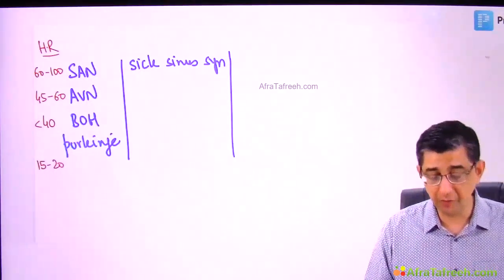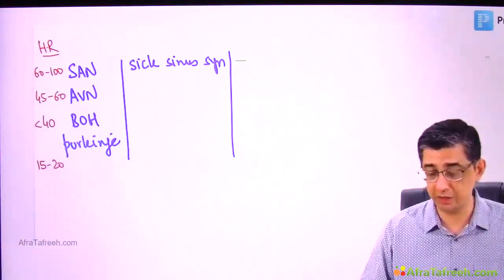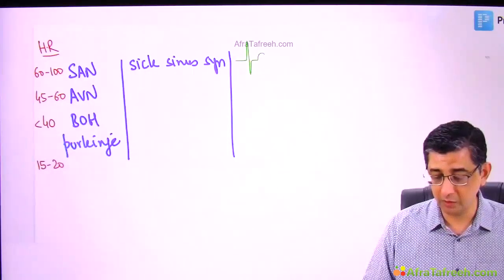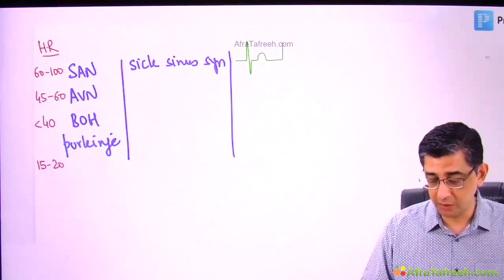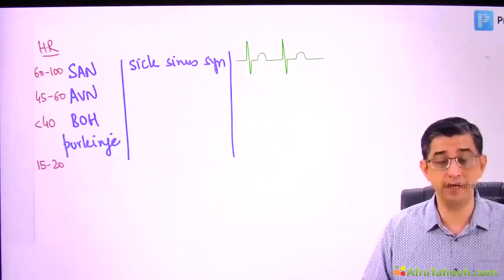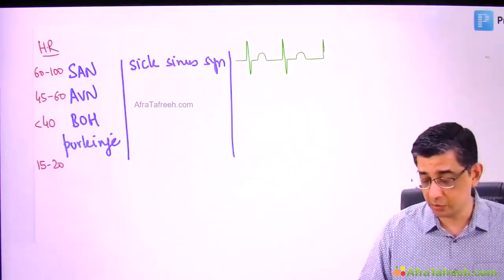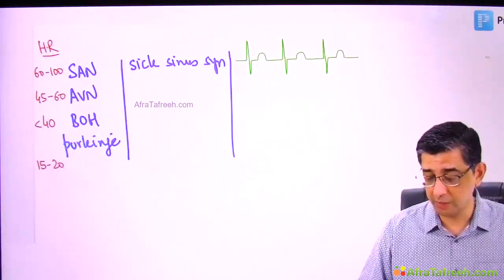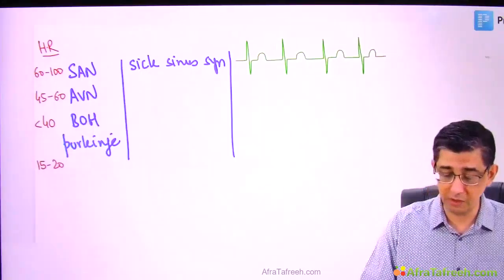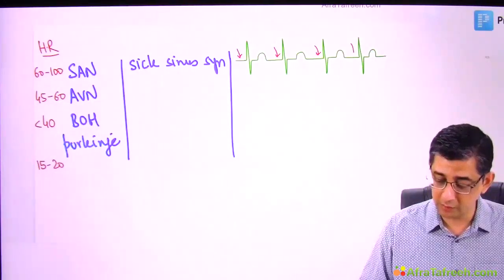Now, in a person who's suffering from sick sinus syndrome, the ECG will evolve like this. There will be no P waves because the SA node is not functioning at the moment. So you will be getting a QRS complex that might be normal, slightly delayed or broad. Then there would be a T wave. I am describing an ECG in which there are absent P waves. There is a tachyarrhythmia in which there are absent P waves, that is atrial fibrillation. But at the moment we're talking about a bradyarrhythmia with absent P waves, which is sick sinus syndrome. T waves might be decipherable, but before every QRS complex, what should always come is a P wave, which is missing in this case. I'll just put a pointer here to highlight that I expected a P wave to be present at any of these areas, but it is missing.